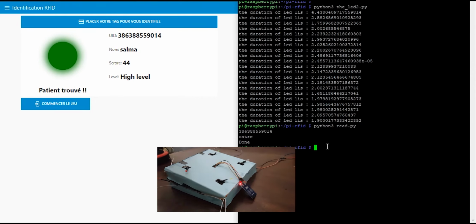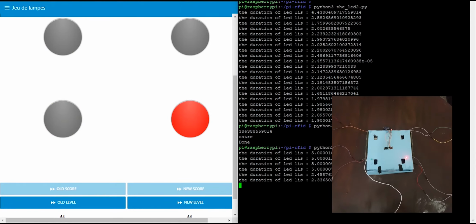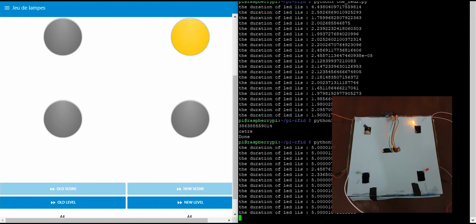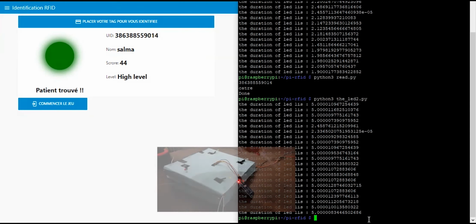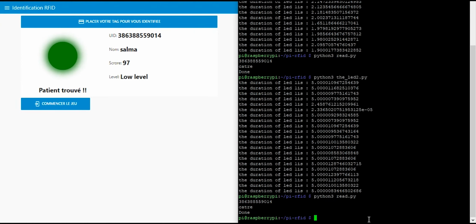To see how the levels function, we are going to restart the program again, but this time we are going to press only a few buttons during the test, and we're going to let the LEDs switch by default after 5 seconds. Here we can see that the data has changed. And for the database, let's check the new level. So when the user scans his card again, he can see that he is in the low level, which means that the patient needs more treatment.